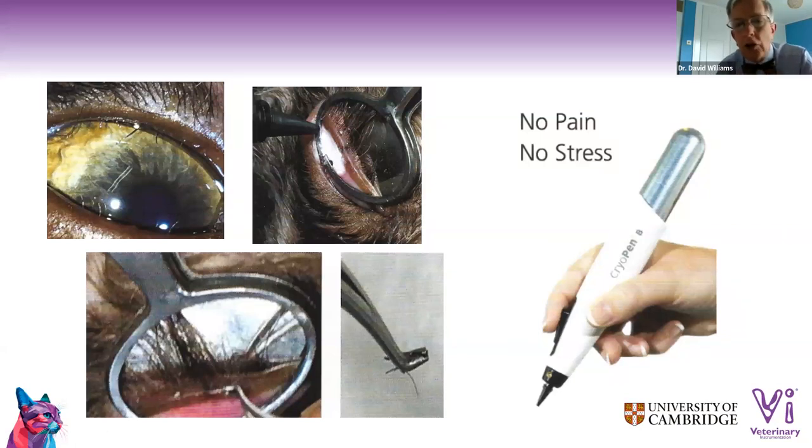What you see, because you're holding the lid with these chalazion clamps, you can actually keep it off the cornea. And because the cryopen has a very, very fine tip to it, you can just go across there, and you're just on the surface. Because you're going on the conjunctival side, unless you have a very thin lid, it doesn't cryo all the way through.